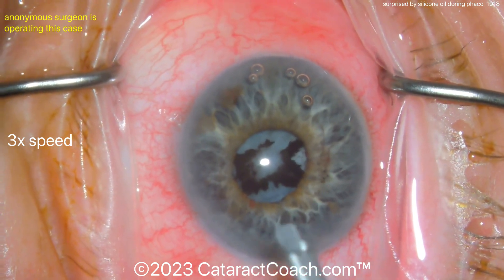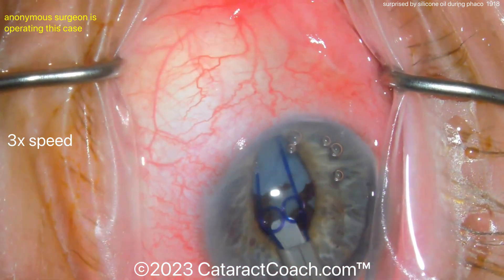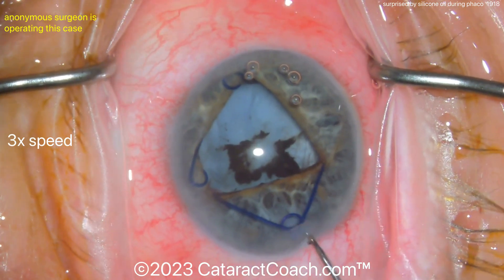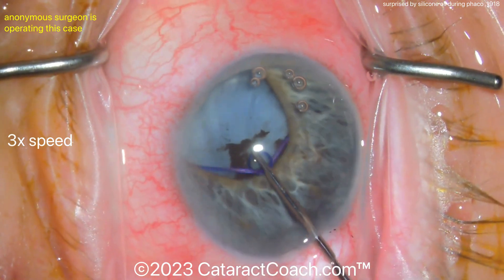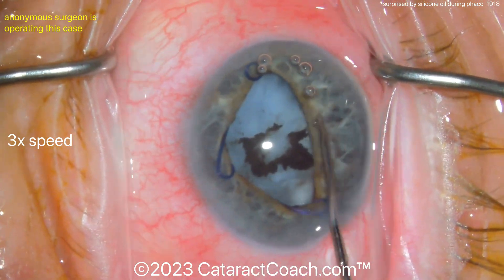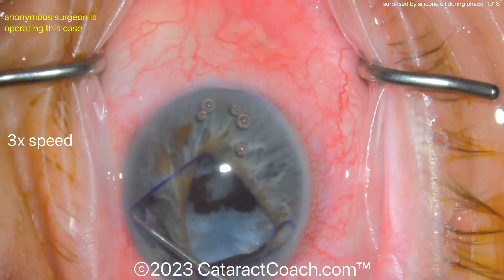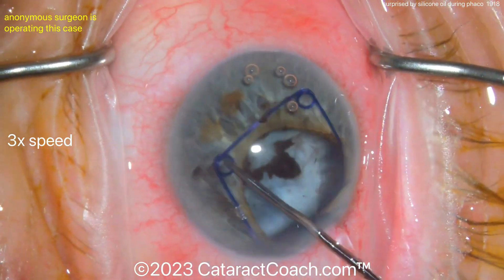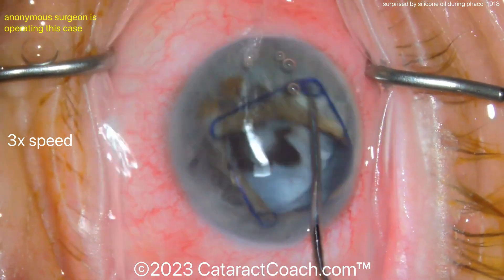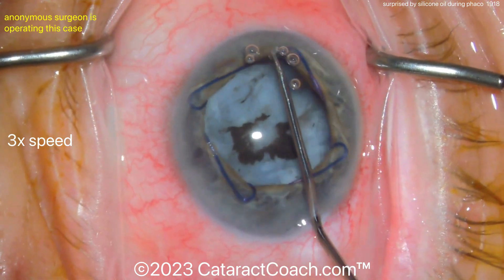But the catch is: why did the vitrectomy cause the cataract? Because you damaged the posterior capsule. You probably have a break in the posterior capsule, and this is why a lot of the lens material has already fallen into the vitreous cavity.